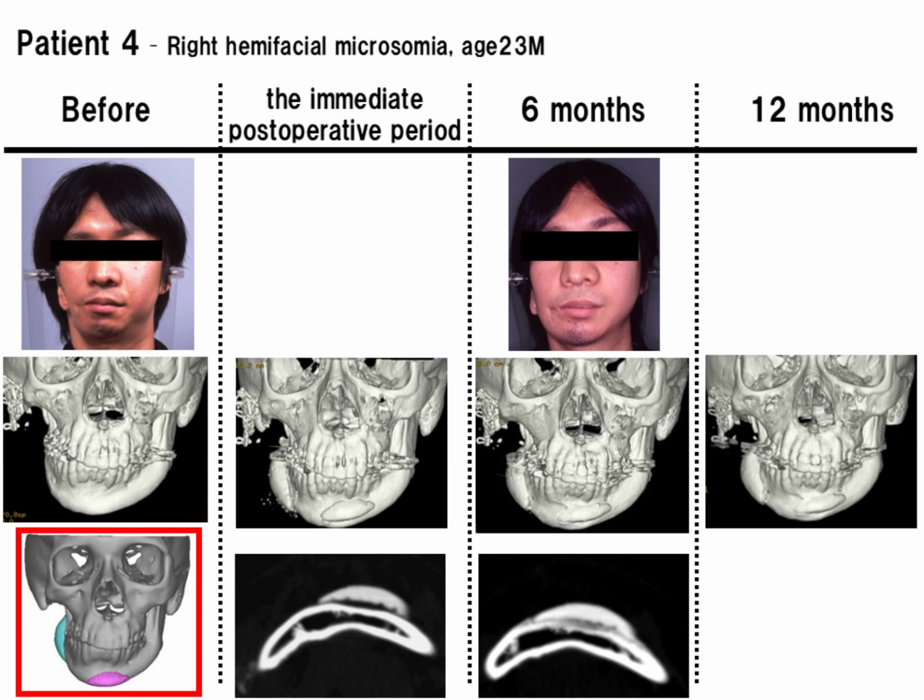Follow-up studies showed that the facial aesthetics improved without any serious side effects, and CT scans taken 6 and 12 months later showed partial integration of the CT bone and the host bone tissue.